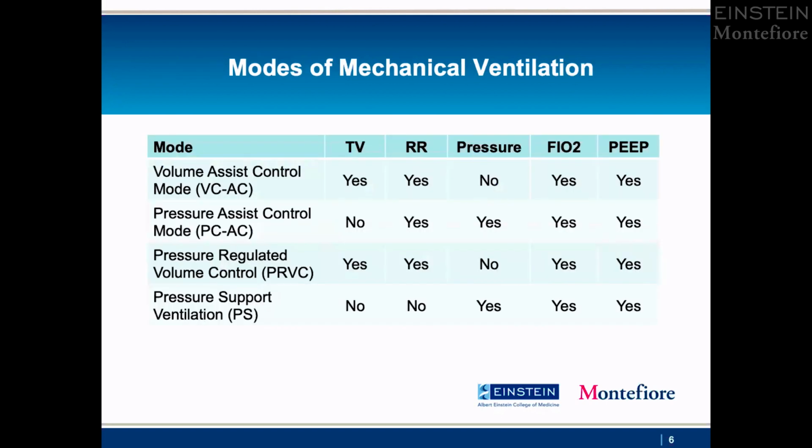This table compares the different modes. With volume assist control mode, the ventilator delivers a set tidal volume with each assisted and controlled breath. The number of controlled breaths is also set.